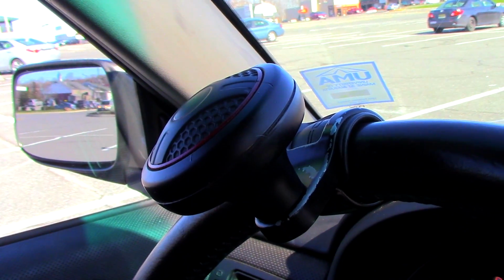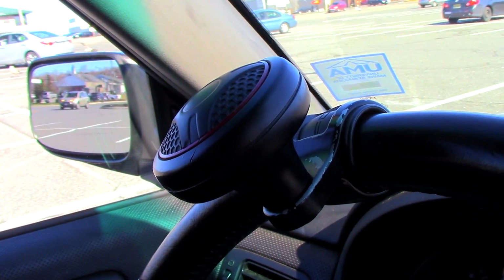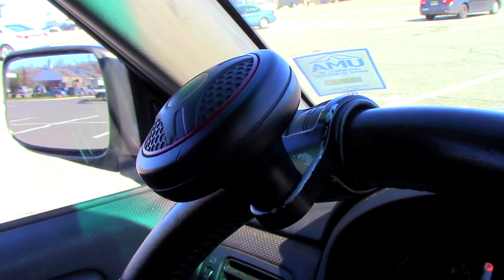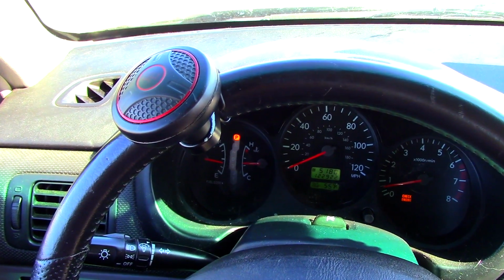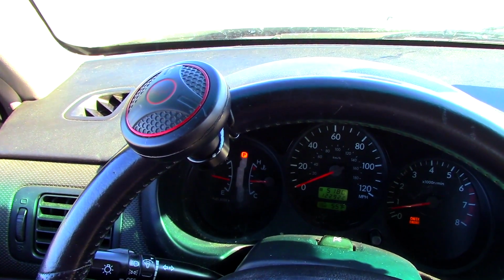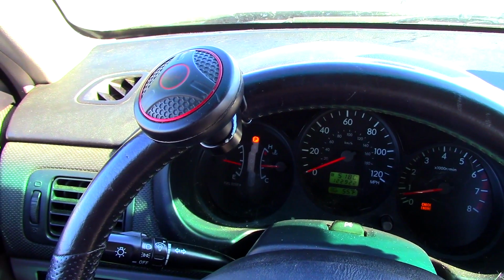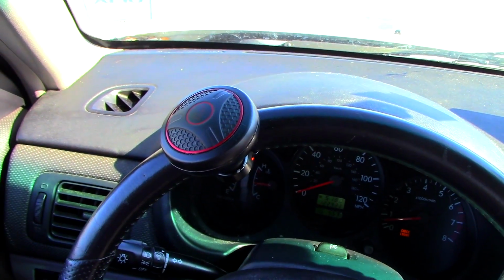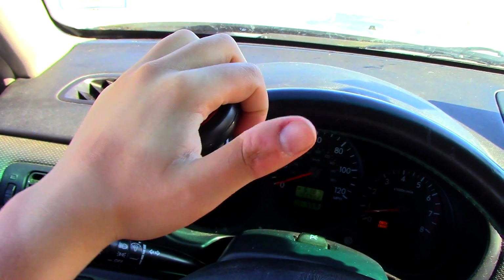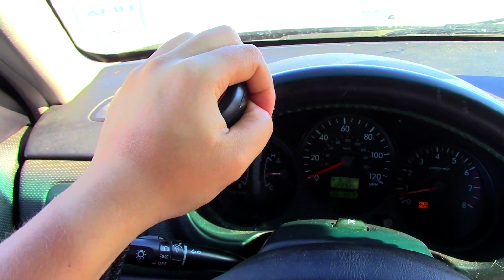The most important feature of a suicide knob is its ability to spin, and that is what allows the driver to safely drive with one hand. It's pretty easy to use. It does take a little getting used to, that's for sure, but I'd say the learning curve is probably no more than 10-15 minutes just to get comfortable with the feel of it. So the driver is just going to grab the knob however they're comfortable. I really just grab it like this and I wrap my thumb around underneath it, and then you just turn the wheel accordingly.